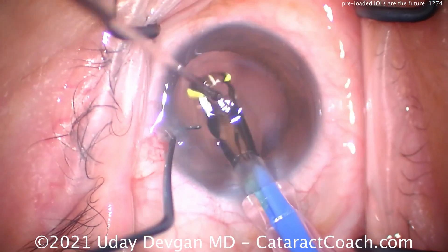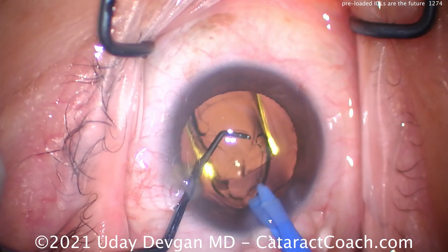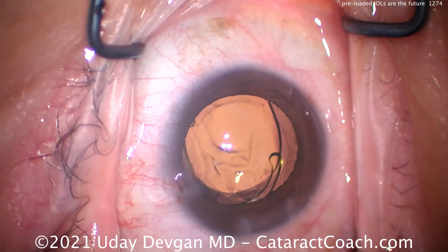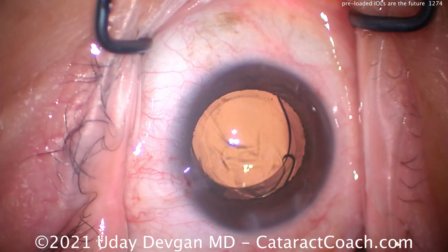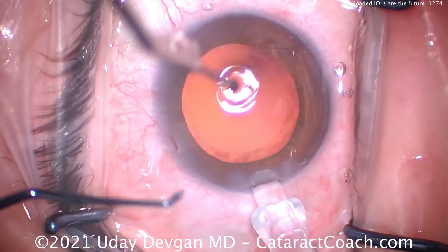It's literally just an index finger trigger or a button to push, and you can use a second hand to help get that in the capture bag. As soon as that lens goes in, your other hand is free — so the non-dominant hand, in this case the left hand, can help deliver the lens. Let's do it again with another case.